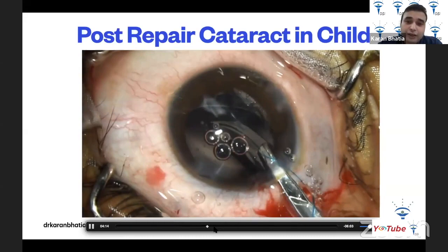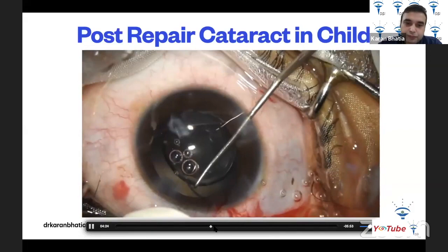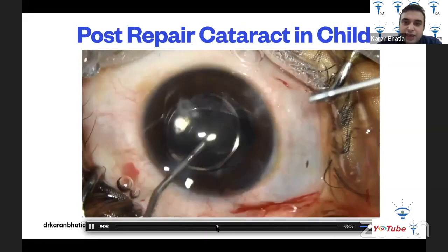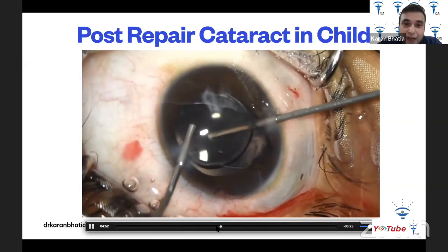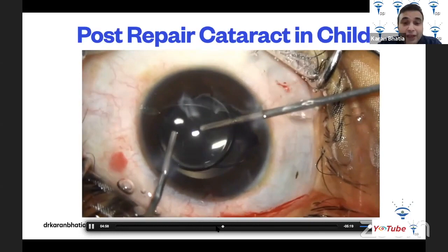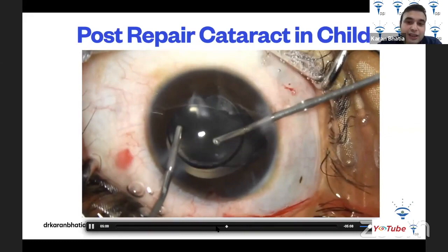Surgery is going well. Since this is a child, after the IOL implantation, a primary posterior capsulotomy or rhexis must also be performed. A vitrectomy cutter is used to go behind the IOL and make a cut in the posterior capsule, because PCOs are very common, very thick, and develop very fast in children, and a four-year-old will not cooperate for YAG capsulotomy later.